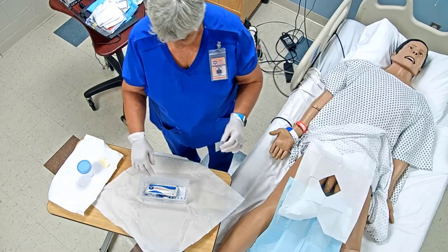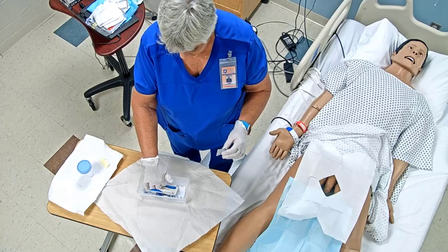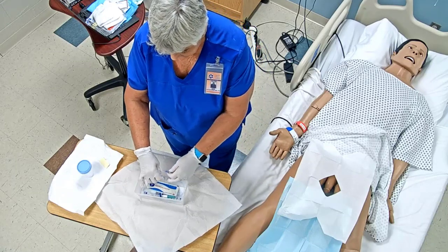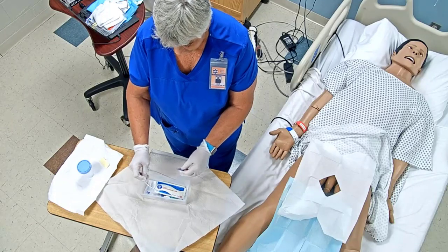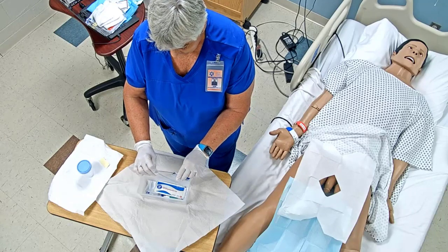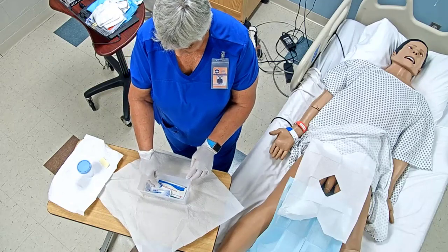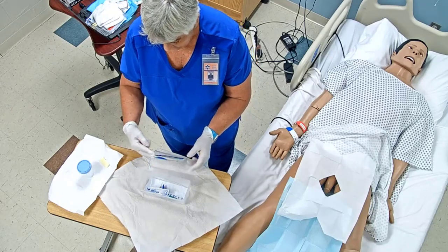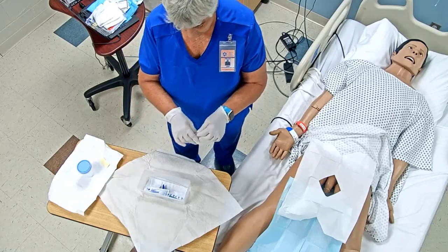Make sure your hands stay above your waist. Okay, I'm going to go ahead and I'm not reaching across, so glove, sterile over sterile, sterile to sterile, okay? I'm just going to slide that back in there right there. And my package is moving around, but I'm still just right here, okay?